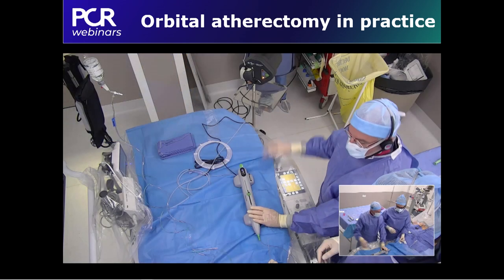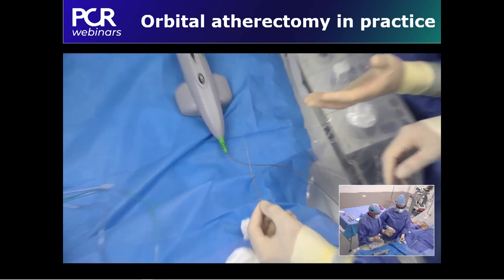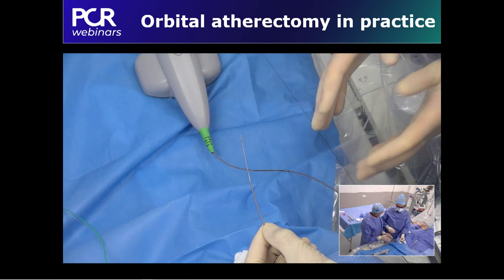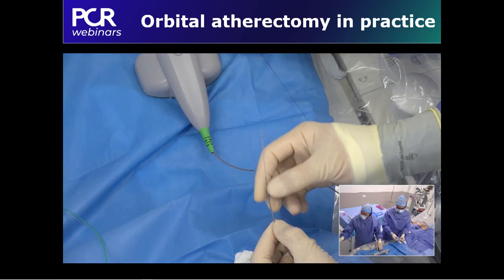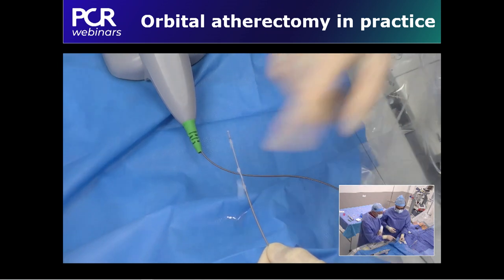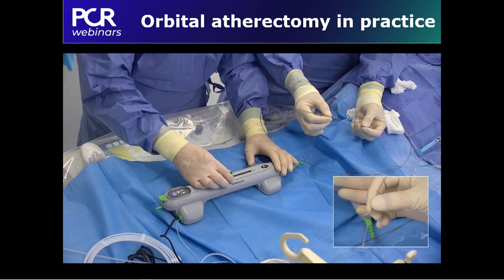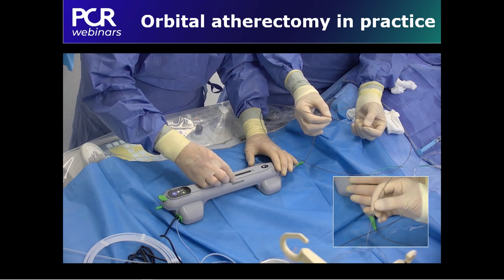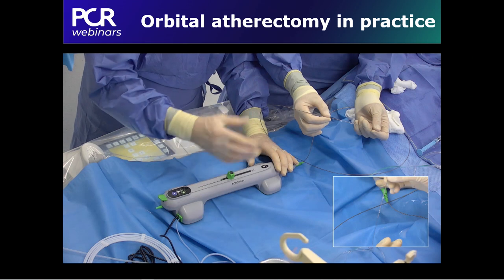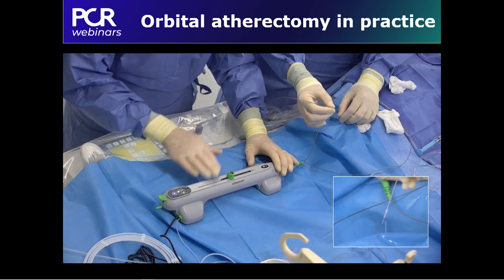Okay. The pump provides flush of the system with lubricant. The lubricant is composed of soybean oil, egg phospholipid, glycerin, and saline solution. So you can activate the system and press the blue button to flush the system. The first knob allows you to power the system on and off, and also to advance the crown. As you see, the axis travel is 7.5 centimeters. So you can treat long lesions with that.